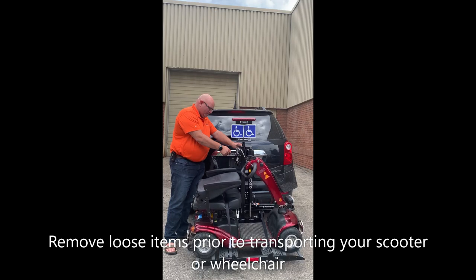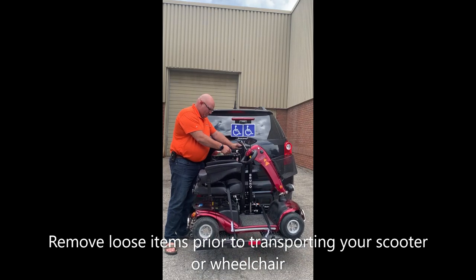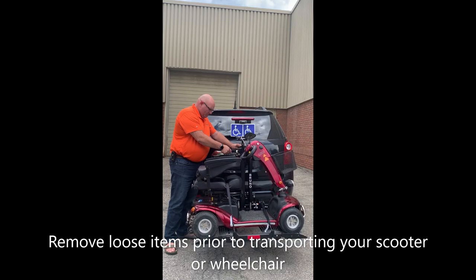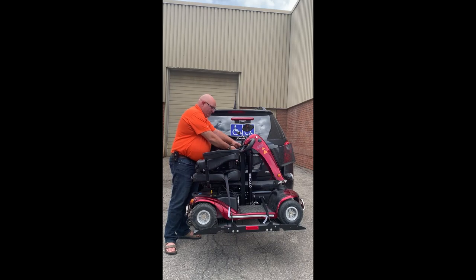Again, once you hear that noise, the lift has reached top capacity. Shut the safety latch. Turn the key and remove it. Replace the cover and you're ready to go.